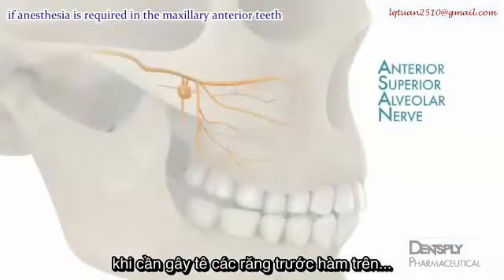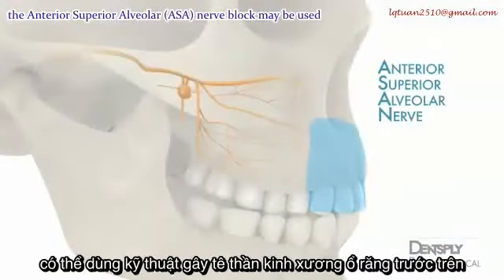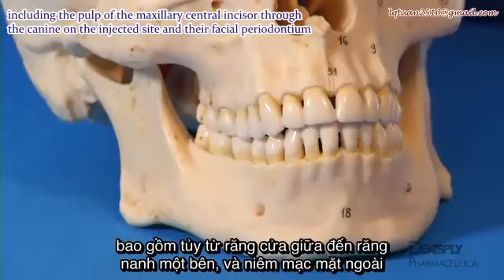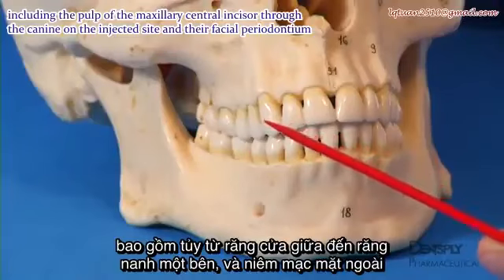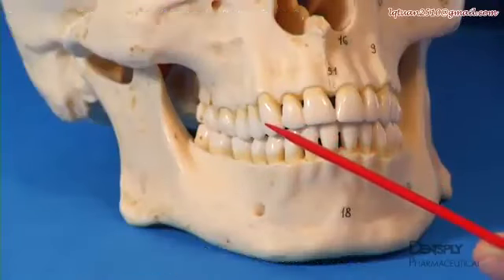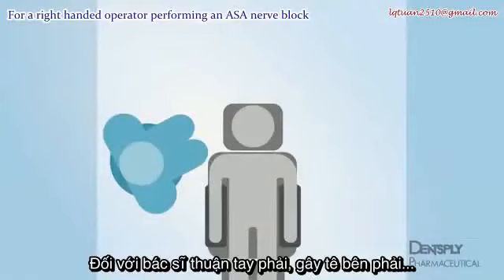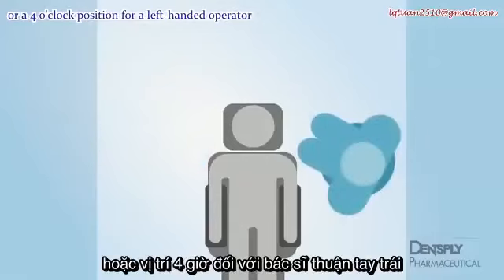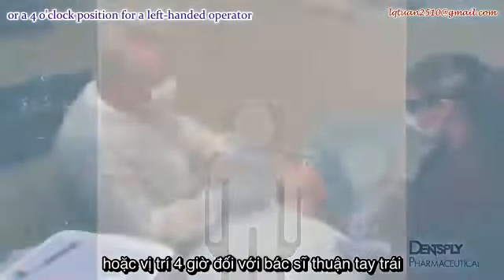If anesthesia is required in the maxillary anterior teeth, the anterior superior alveolar nerve block may be used. The anterior superior alveolar nerve block anesthetizes structures innervated by the anterior superior alveolar nerve, including the pulps of the maxillary central incisor through the canine on the injected side and their facial periodontium. For a right-handed operator performing the anterior superior alveolar nerve block, the clinician may be seated in the 8 o'clock position, or the 4 o'clock position for a left-handed operator.